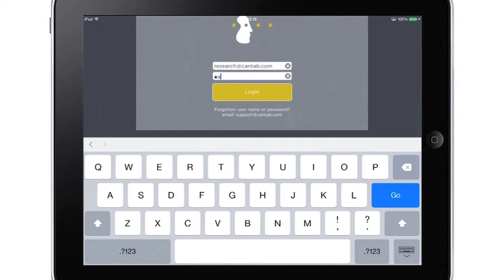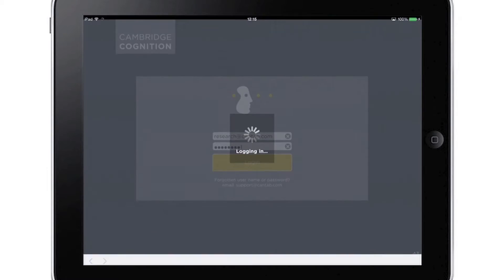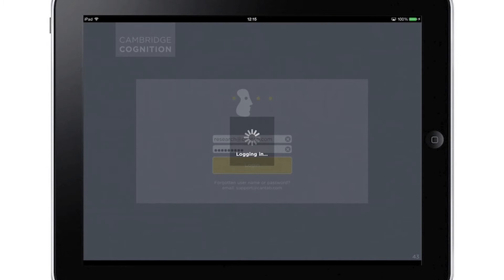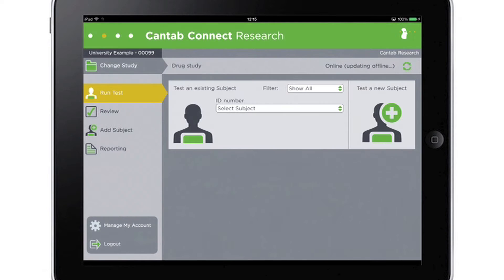When users log in, the system knows what kind of user they are and what level of access they have been granted. For example, some users can be configured so they are only allowed to collect data but not create new studies, such as research assistants.